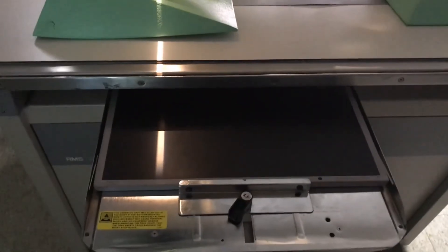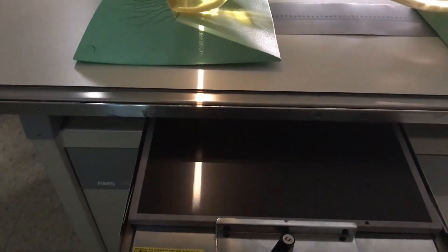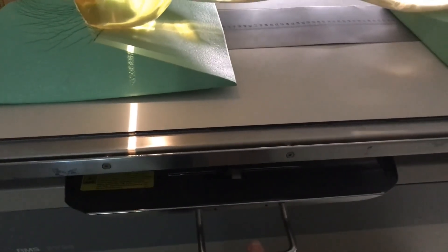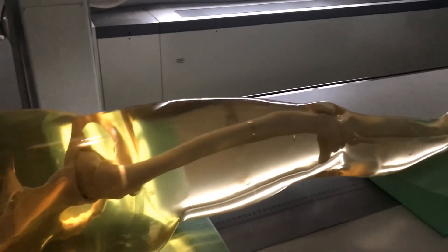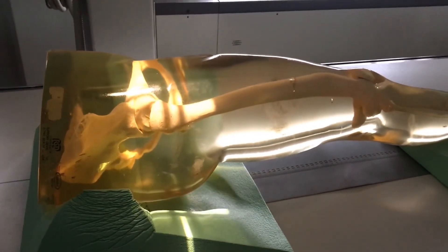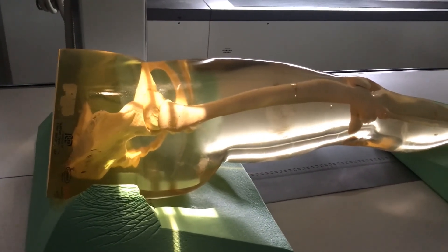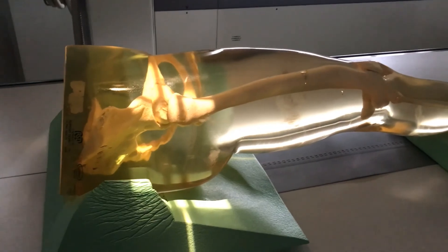I am lined up to the top third of my bucky tray, pushing this in not all the way. I'm gonna center my crosshairs ideally on the femoral neck. You can't visualize the femoral neck directly, but you know where the greater trochanter is — it's in a really similar location. So I'm gonna do one small image here. This is not an entire 10 by 12 of a hip.